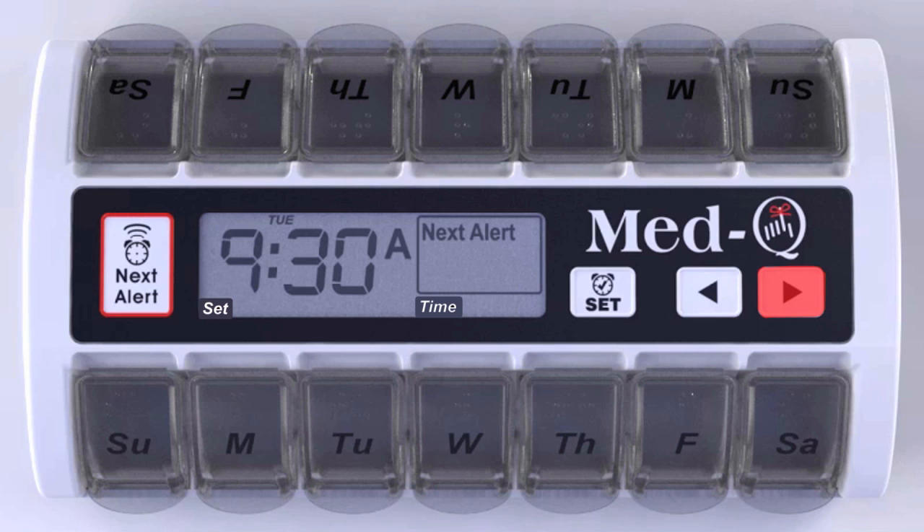Using the arrow key, scroll to A for AM or P for PM and stop pressing. Press the set button. The days of the week will start to flash on the top of the LCD screen. Using the arrow key, scroll to the correct day of the week and release. Your time and day are set.